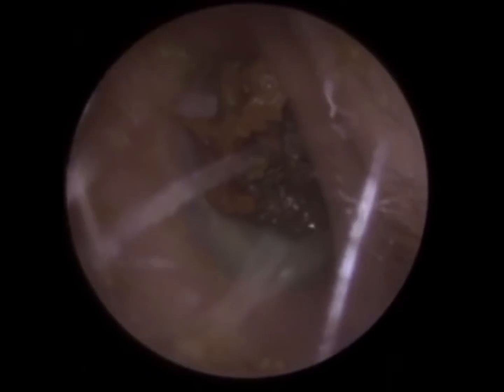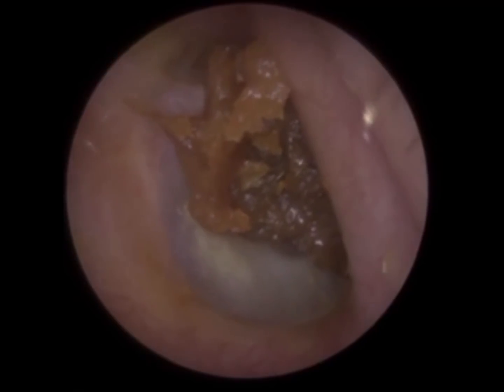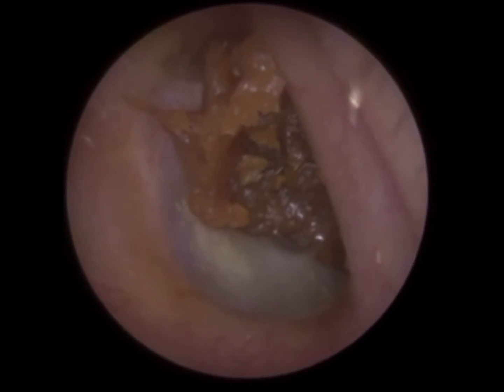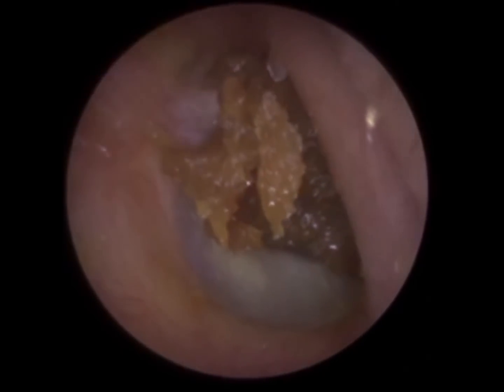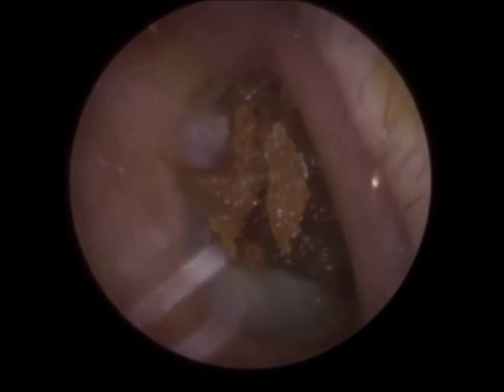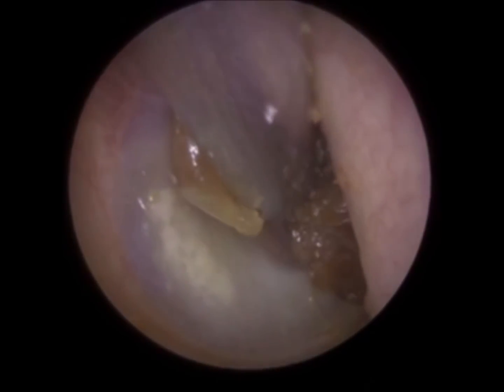So we just got a bit more wax, just impacted on the eardrum. It's just blocked my suction probe. I'm just wriggling it outside, but it's not unblocking. Oh, no, it did unblock, so I've gone back in. And the wax is stuck in the anterior recess. You can see it's quite mushy, this section of the wax. So I just had to come out, unblock the suction probe, but right on the eardrum here.